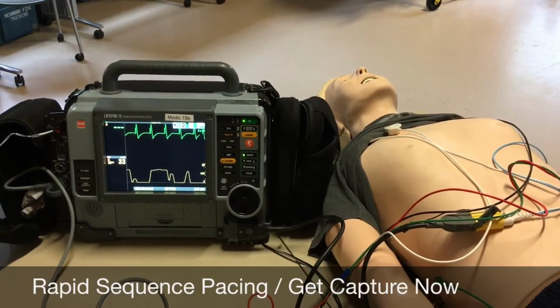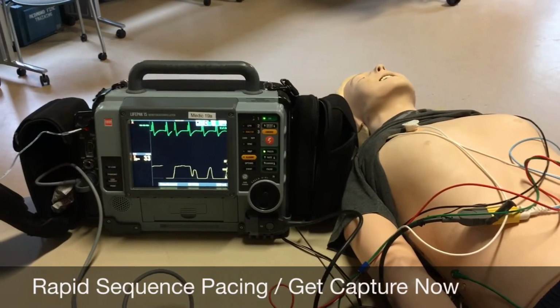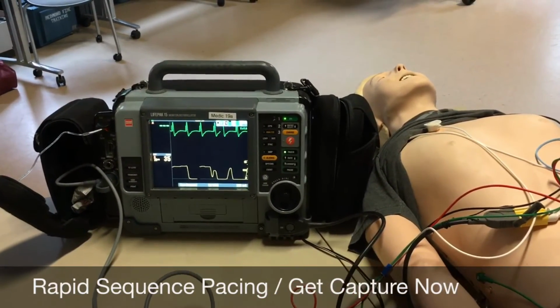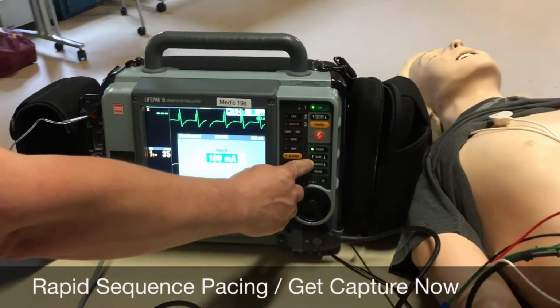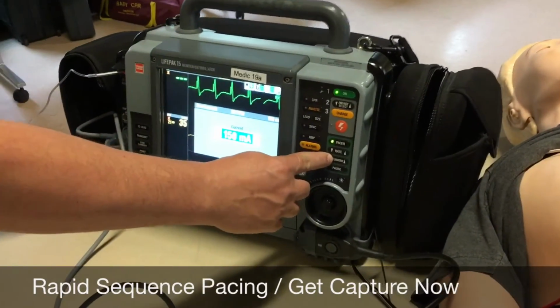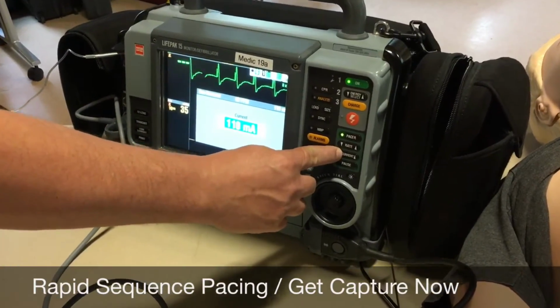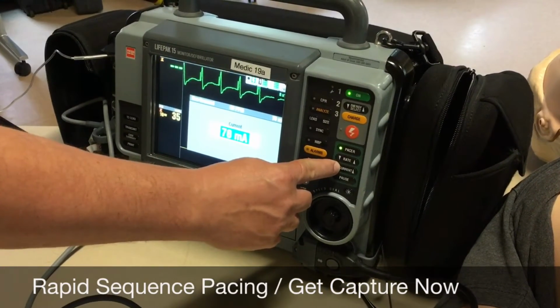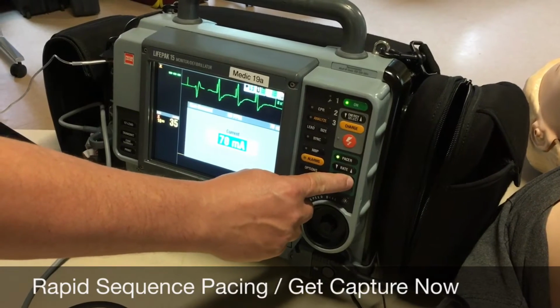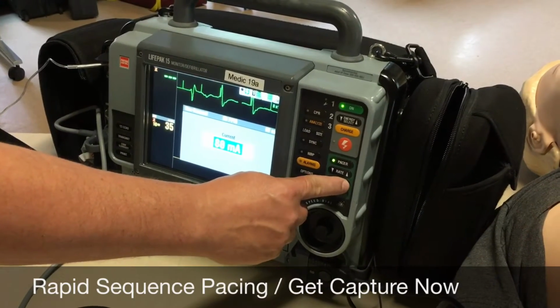Once you've got capture immediately like that, you notice that took me 3 seconds to do, then you're going to come in here once you have capture and back your milliamps down until you lose capture. And then you're going to bump it up until you get capture.